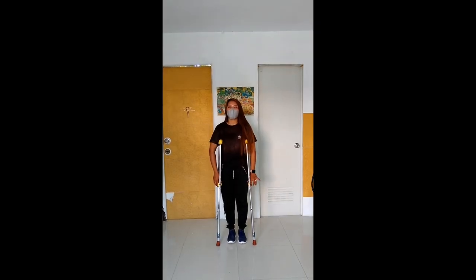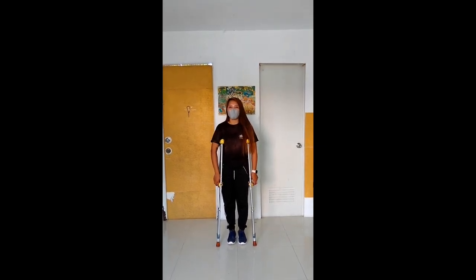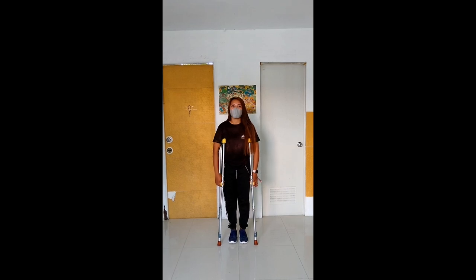Ang susunod naman ay swing-through gate. Halos paras lang siya sa swing-to gate. Pero lalagpas lang yung pa yung sa crutches.